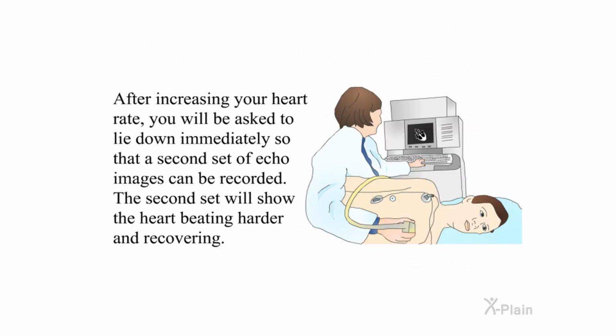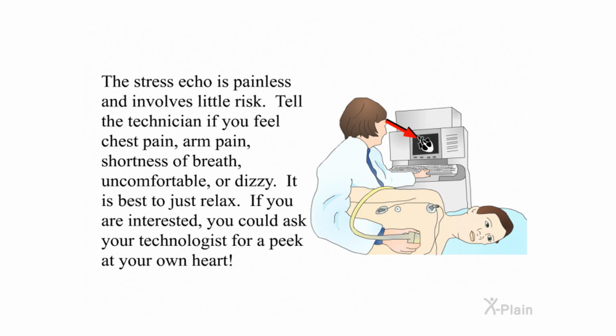After increasing your heart rate, you will be asked to lie down immediately so that a second set of echo images can be recorded. The second set will show the heart beating harder and recovering. The stress echo is painless and involves little risk. Tell the technician if you feel chest pain, arm pain, shortness of breath, uncomfortable, or dizzy. It is best to just relax. If you are interested, you could ask your technologist for a peek at your own heart.